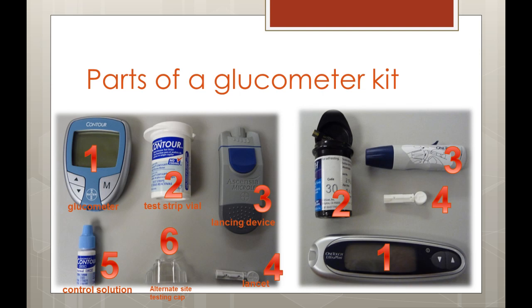Other materials that may be included with a glucometer include a bottle of control solution, an alternate site testing cap, and the carrying case.